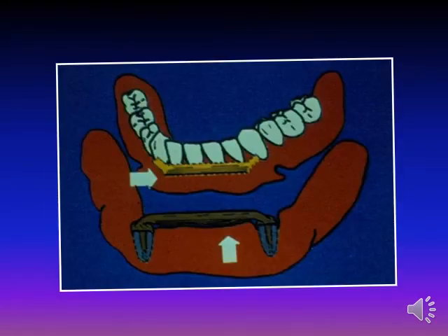Rotherman. When we come to attachment, the fifth technique is reserved for the situation in which not only stability is desired, but in which significant improvement in retention is desired. Because of the added time, cost, and risk, this procedure should be reserved for patients with favorable prognosis. Two main types of attachment shall be discussed: the stud and bar attachment, and there are other attachments, the magnet and telescopic crown.